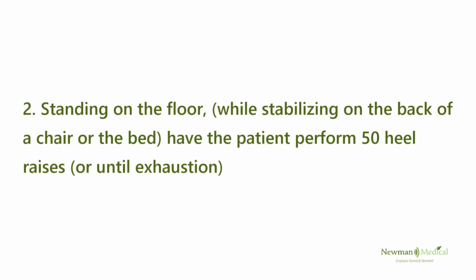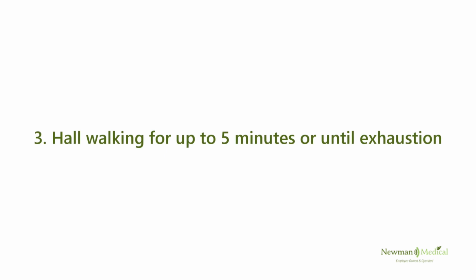2. Standing on the floor, while stabilizing on the back of a chair or the bed, have the patient perform 50 heel raises, or until exhaustion. 3. Hall walking may be performed for up to 5 minutes or until exhaustion.